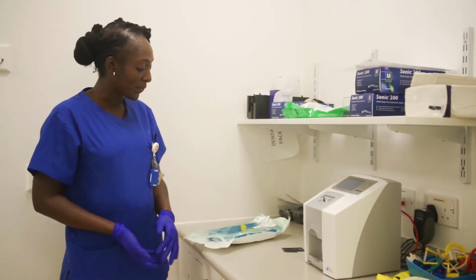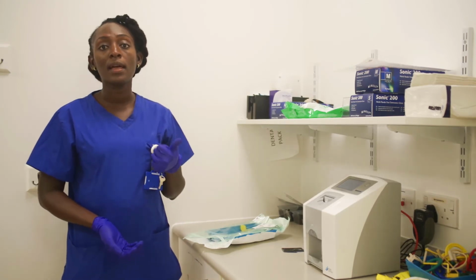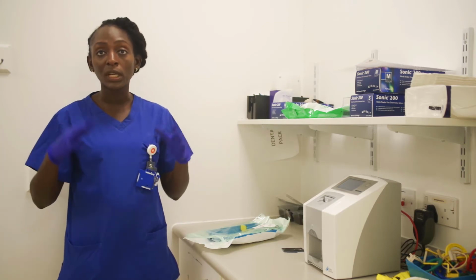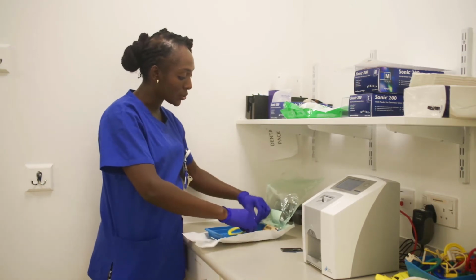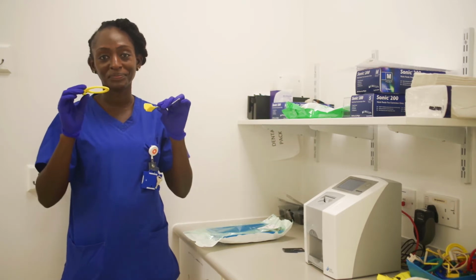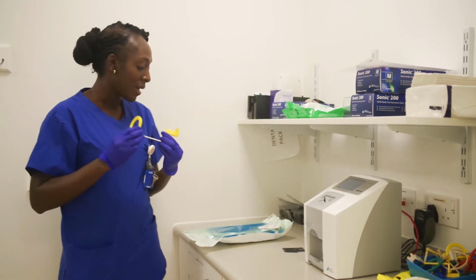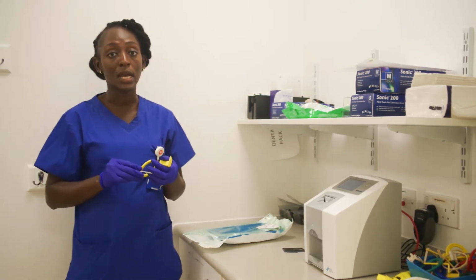Okay, so there are two holders for periapicals: the anterior holder and the posterior holder. We've got another for bite wings, but this is in another video, though we'll recap it in this video as well. I think we showed you this in the lecture. Can you remember what we call this particular holder? I'll give you a few minutes, pause your video and try and think about it. Yes, you're right. This is a posterior holder, and a posterior holder means that you're going to take areas 4 to 8, posteriorly, upper and lower.